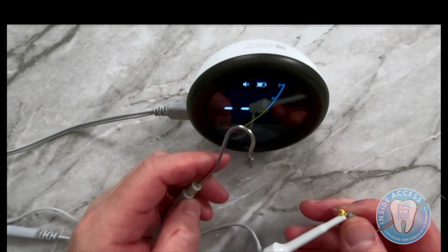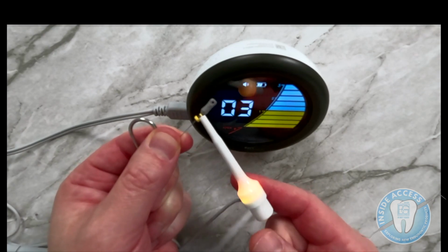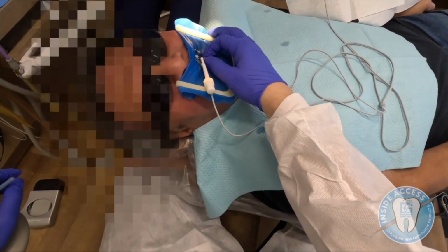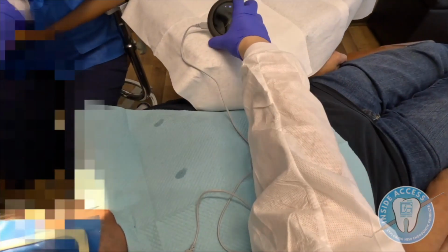Again, this is the Apex Connect, and what's really cool is that you actually get a light up on the file clip. And this corresponds directly to what you're seeing on the display. So as I progress down, what you'll see is that the file clip will start to light up. It's yellow. Now look how it blinks red that I'm out in the apex. I think this is a really cool feature.